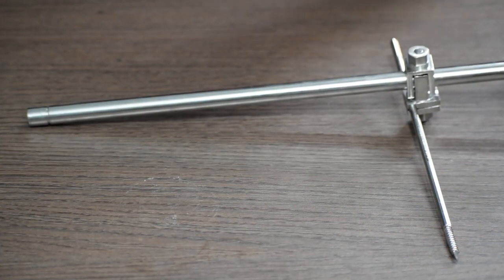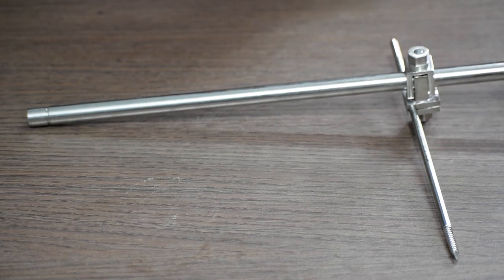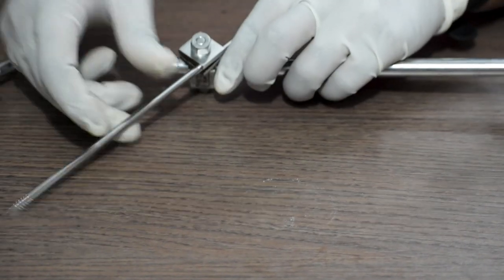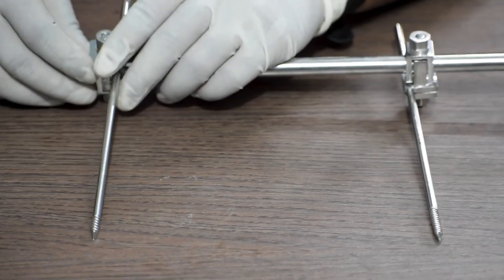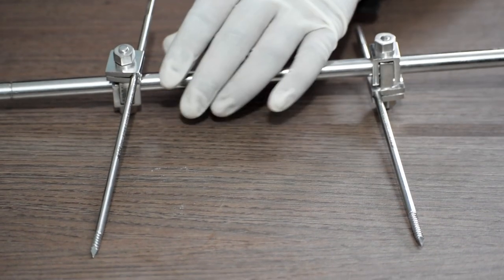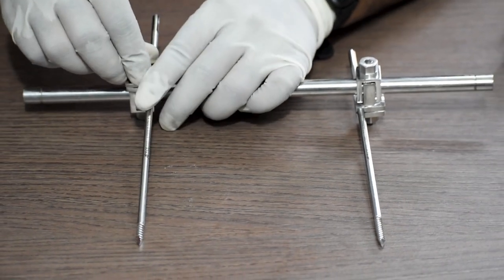Similarly, we can fix another Schanz pin with the help of a single pin clamp. We will do the exact same process like the first one. This was for the single rod fixation.